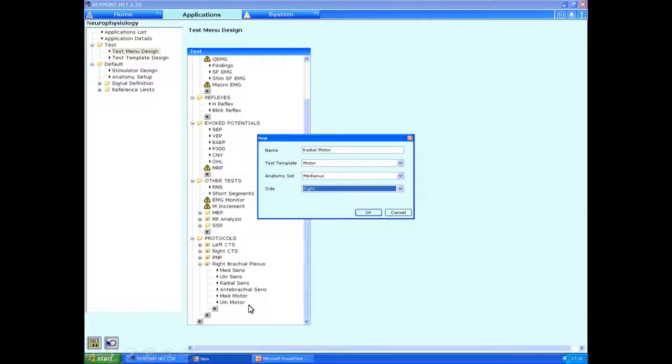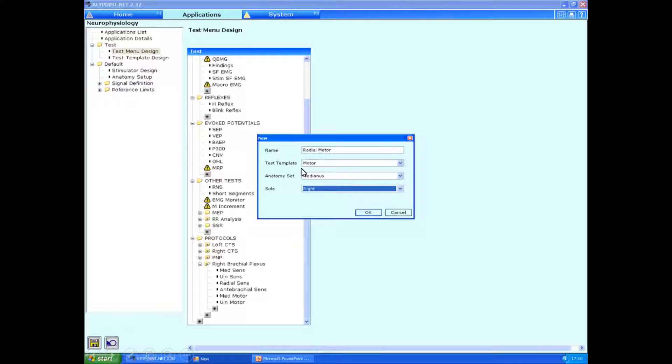This time around, I want to add in the radial motor study. And it's not as standard set up to do this in the test template design. So if I type in radial motor here, go to the motor template. In the anatomy set, I haven't as yet got the radial motor study. So we're going to have to add this in.